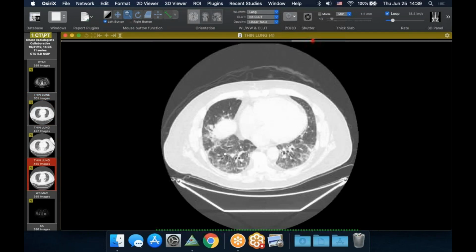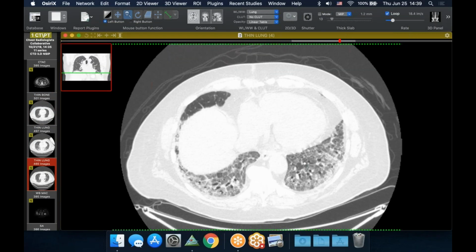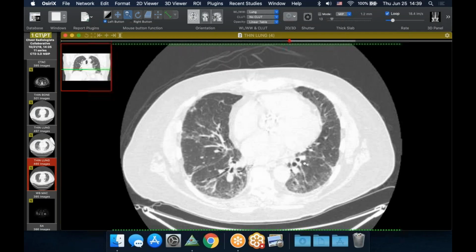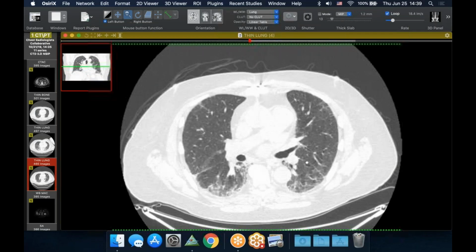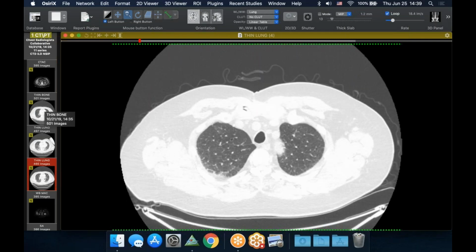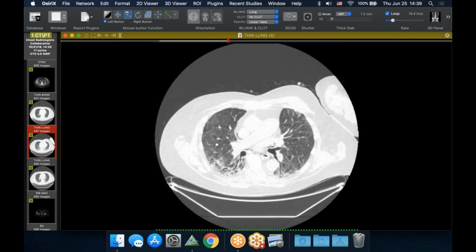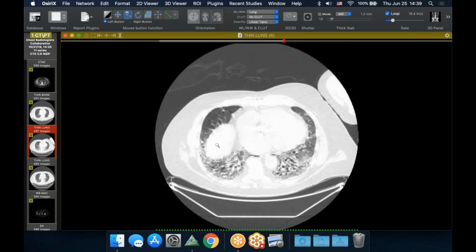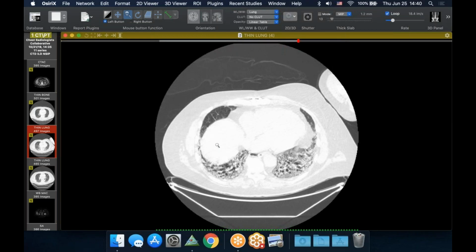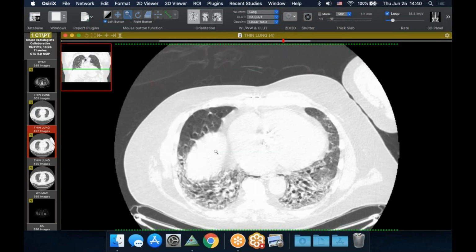about 6 months, and we can see it's actually increased quite dramatically. A lot more traction bronchiectasis, much more ground glass. So very NSIP looking appearance, has some underlying heart disease as well. And now the most recent scan, that's this one here, we see just really dramatic increase and actually developed pneumomediastinum spontaneously and really severe lower lobe traction bronchiectasis. So becoming more and more symptomatic.